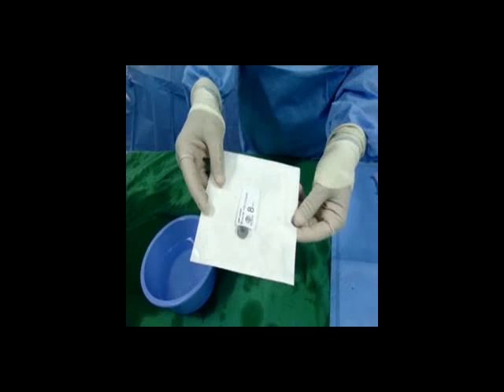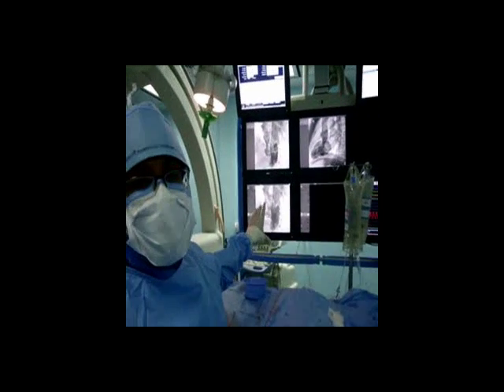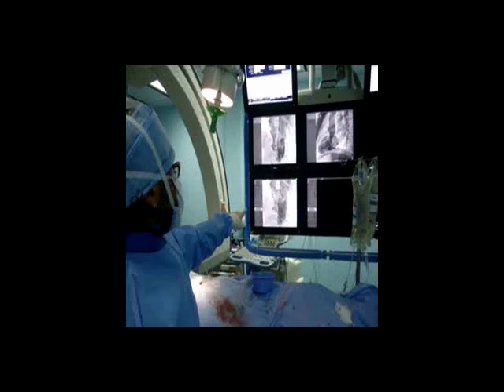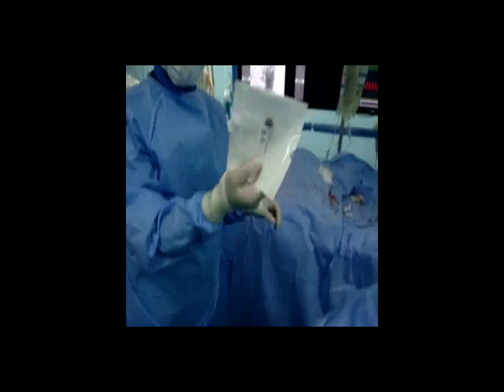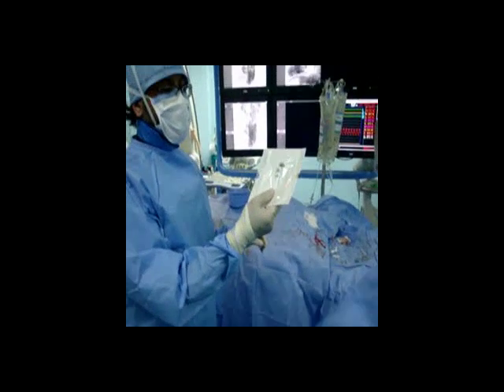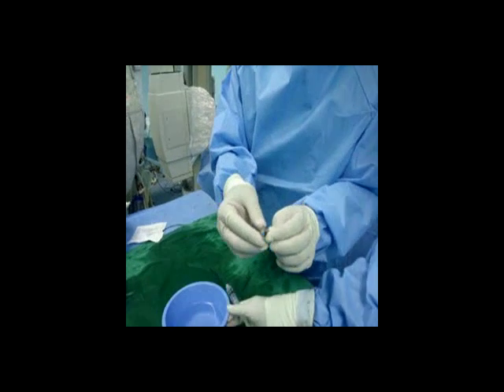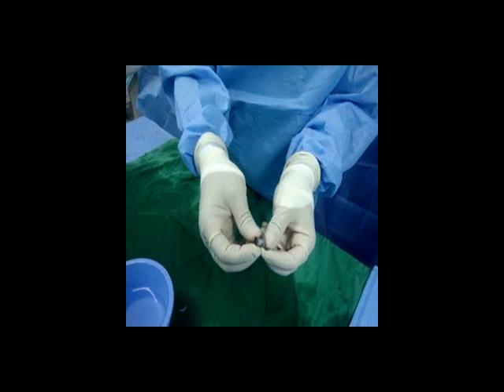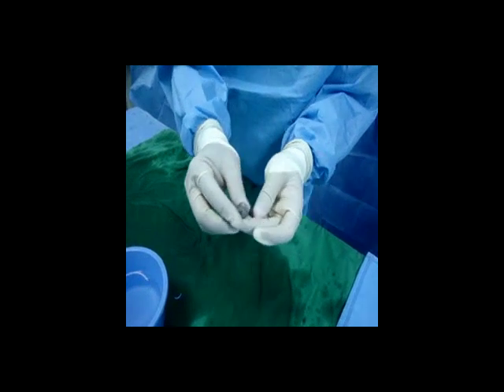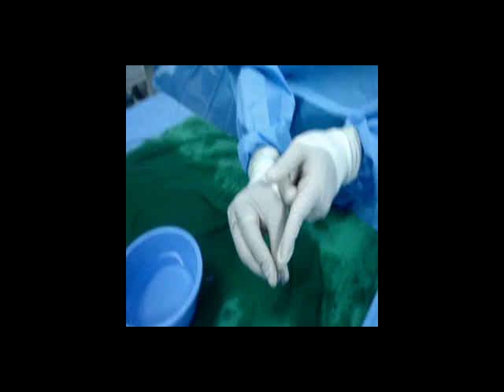This is an 8mm muscular device. The VSD itself is big — around 18 to 20mm — but as you can see, it is making a pouch here, and the narrowest part is around 4 to 5mm. So we chose an 8mm device. As you can see, the internal diameter is 8mm and there are wings on both sides. It's different from the perimembranous VSD device; the waist here is really wide.